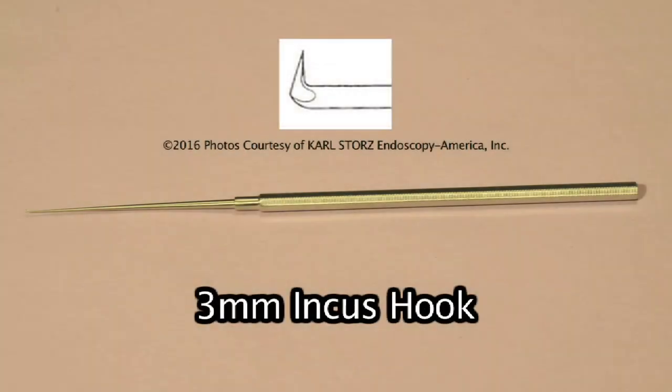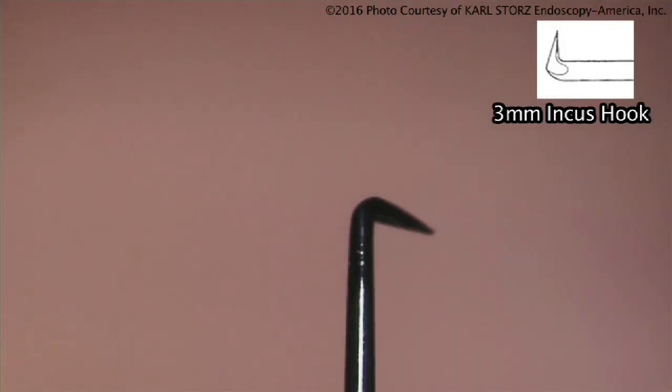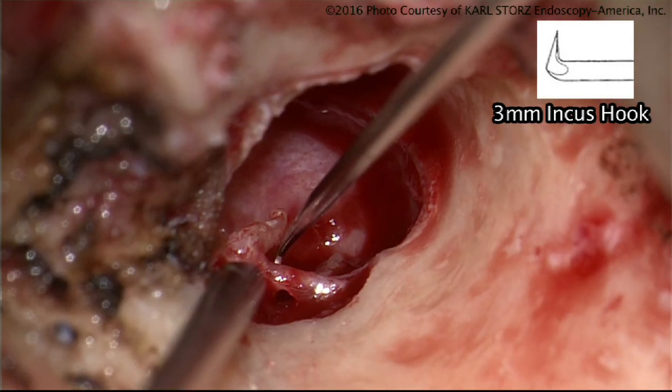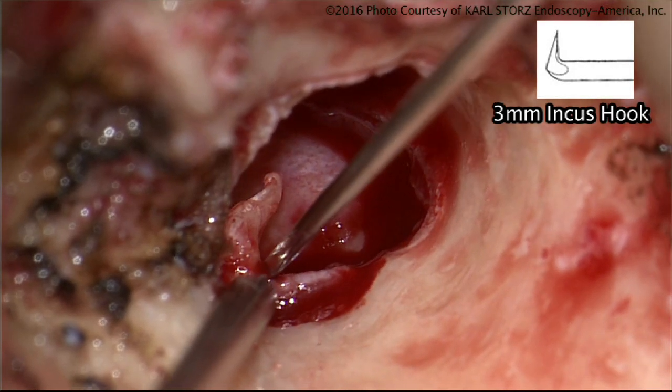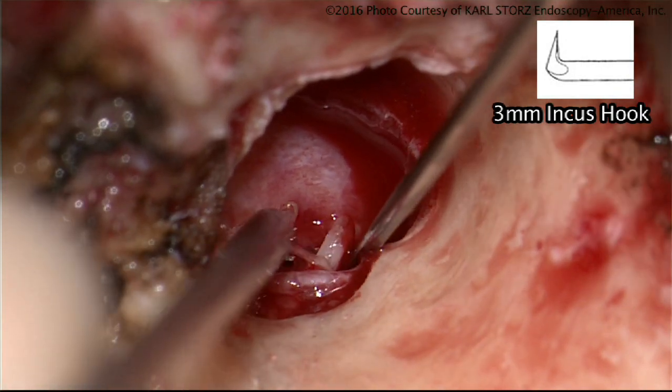The incus hook is used to separate the incus from the malleus. It's helpful for pulling the incus out of the epitympanic space and removing it from the middle ear space. The three-millimeter hook is also very useful for other dissections — we use it in skull base surgery for dissection of tumor, and having this sharp hook to separate the tumor away from the facial nerve can be very helpful.